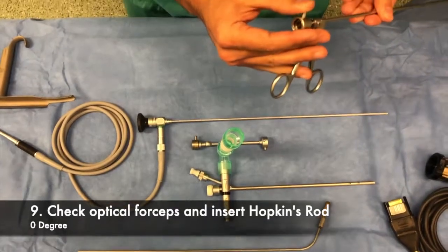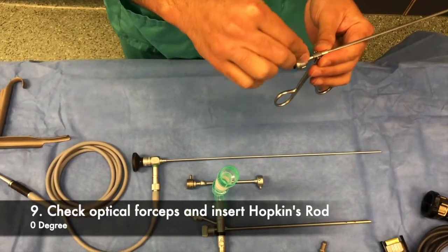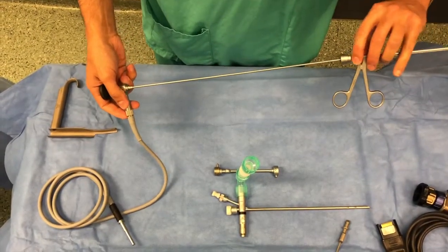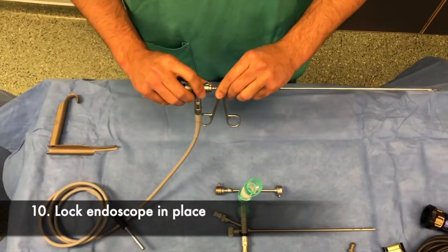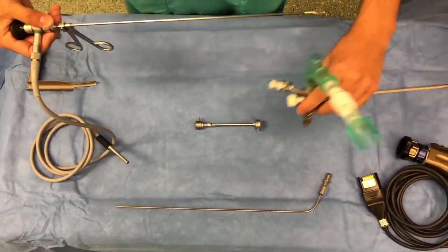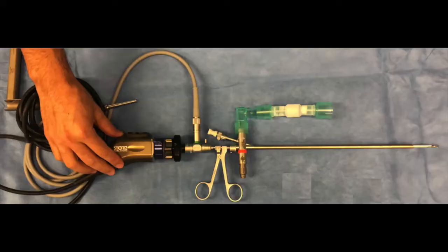Next, check the optical forceps and insert the Hopkins rod through the optical forceps. The endoscope must be locked into place to avoid rotation. The instrument can then be passed through the end of the rubber bung, and this is the final position that it would take.